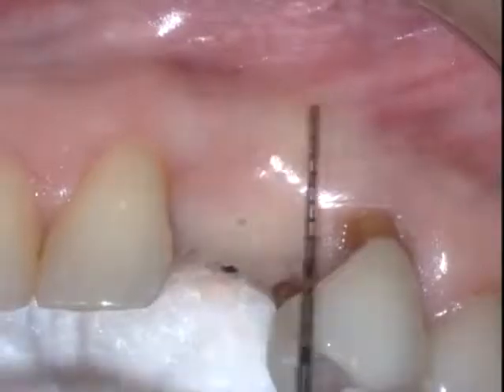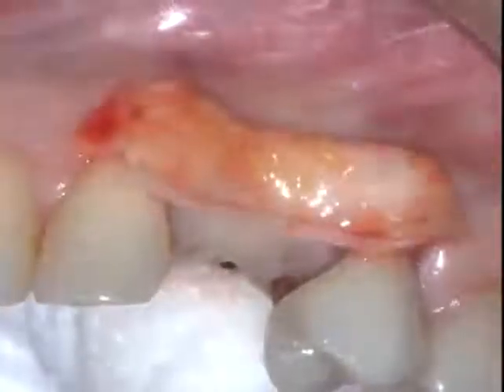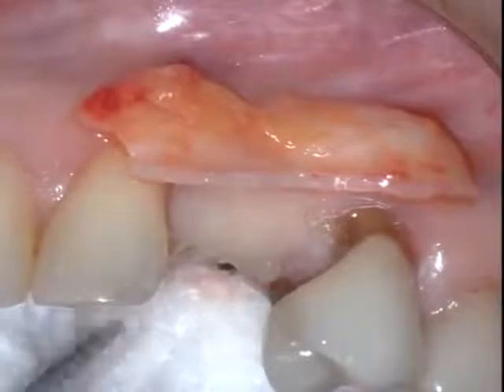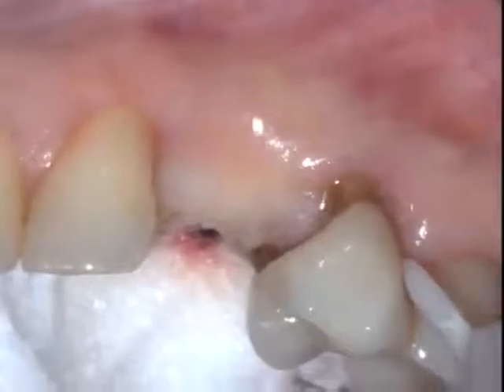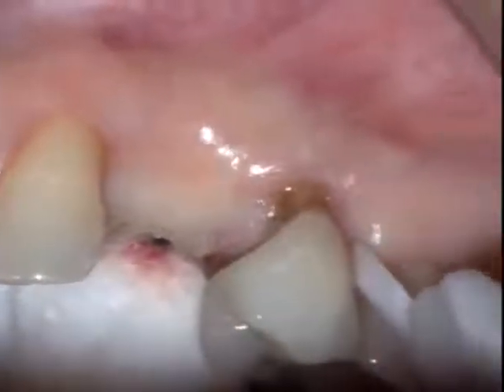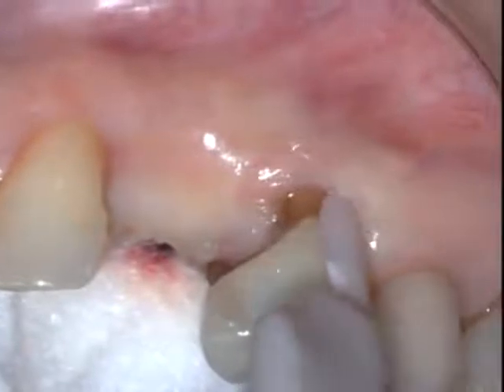This is very important on the adjacent natural teeth, which also showcase some previous recession. As you can see, the soft tissue graft, connective tissue, autogenous in nature, will be utilized simultaneously to assist us in augmentation of the adjacent natural teeth, as well as the buccal concavity remaining in the area of the dental implant. A zirconium or zirconium oxide scalpel is utilized.